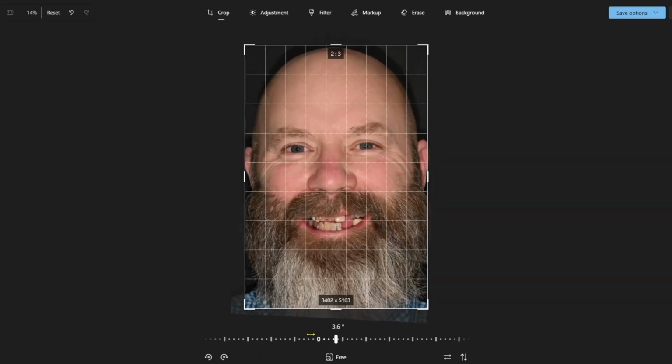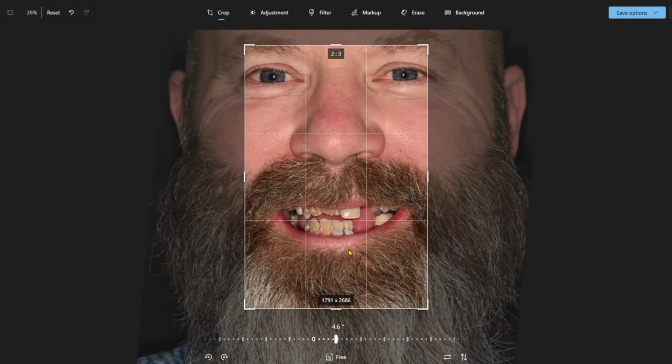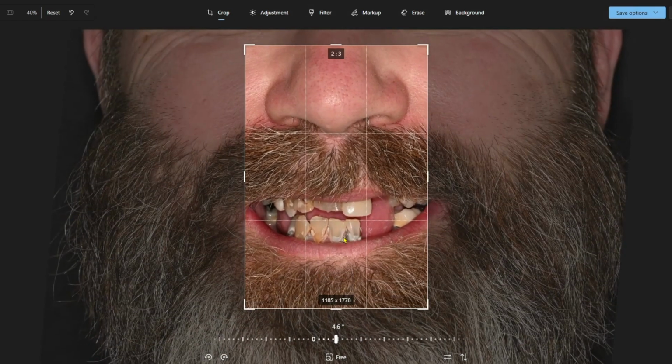I like to come in here in this edit tool, and then you can resize and crop everything. So we've added, like I said previously, about 1.3, 1.5 millimeters of length in the design. We wanted to show a little bit more teeth, but photos are very important in the treatment planning of these full arch cases or in any cosmetic treatment plan.